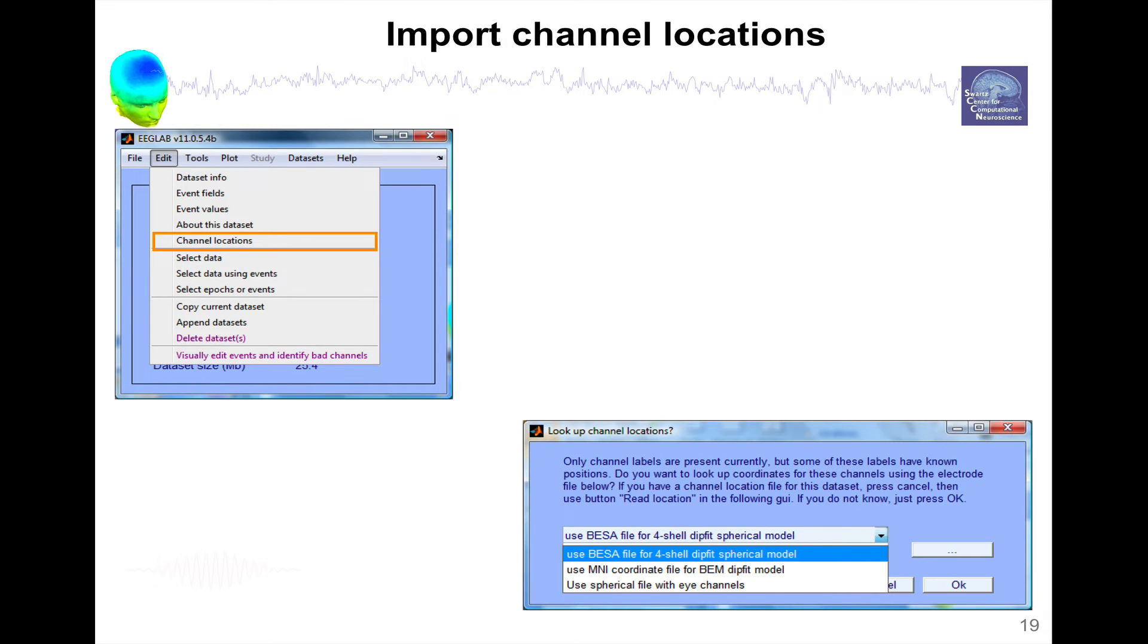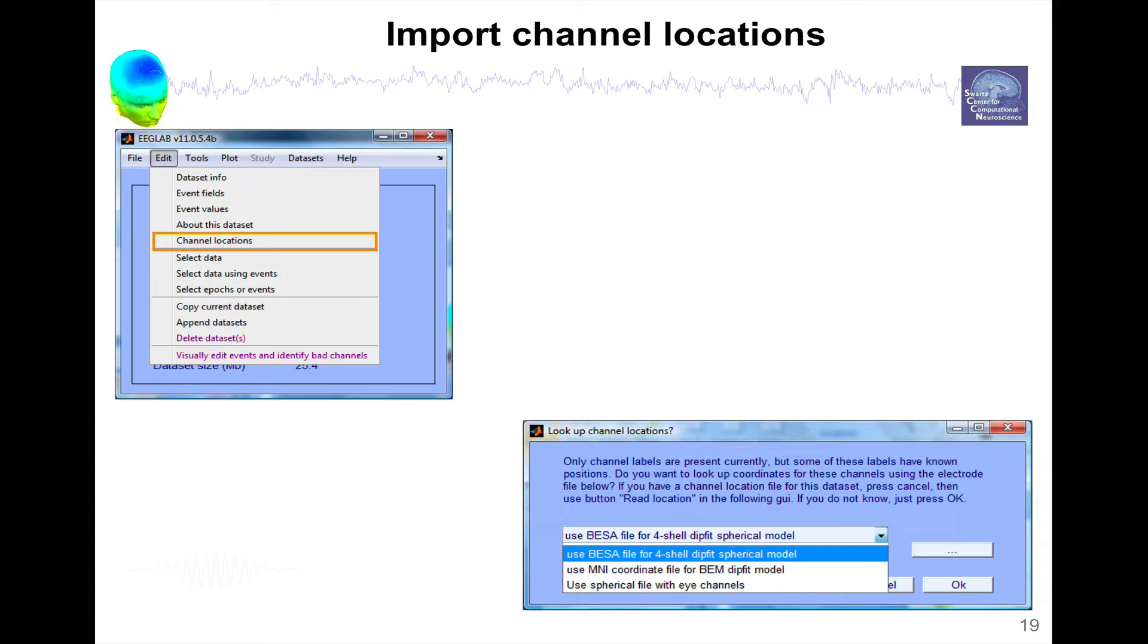You have a pop-up window and it asks you, do you want to use the channel labels to figure out some channel locations for these electrodes, for these channels? Very often in the raw data file, there are channel labels associated with these channels. So even though they might not have locations, they sometimes have channel labels. And we can use these labels to figure out some template locations.